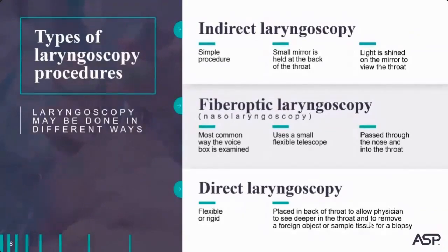A fiber optic laryngoscope or nasal laryngoscope often has no channels, so cleaning and disinfecting, or high-level disinfecting or sterilization, is surface-related, therefore simplified, versus some of those other types of flexible scopes that are more complex, like GI scopes.